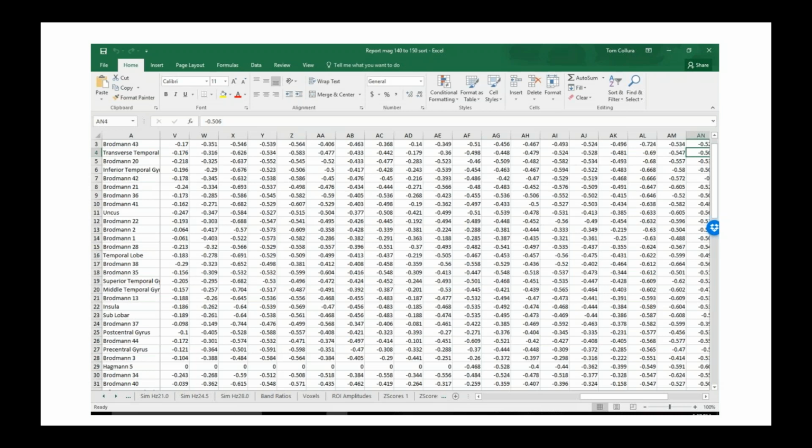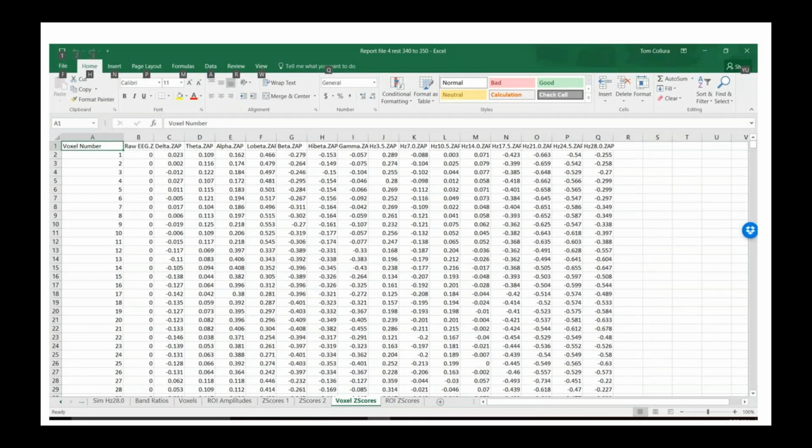The overall energy in the EEG does tend to go down, but what remains tends to be phase locked with the stimulus. And some people think the evoked potential is nothing but the phase locking of the endogenous activity to the stimulus. Pfurtscheller, Klimesch, and others, and myself tend to move in that direction.